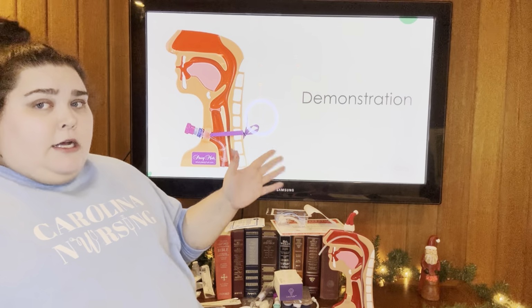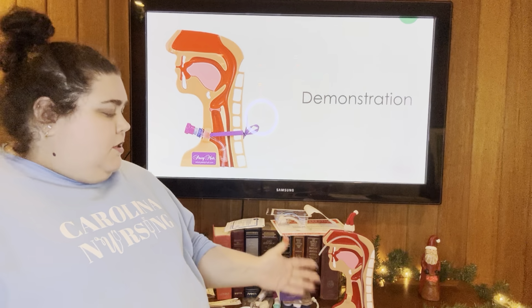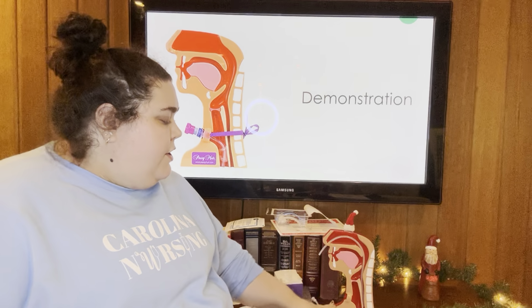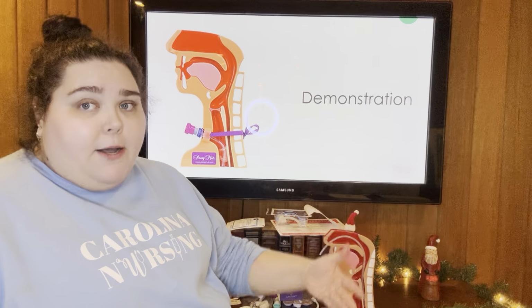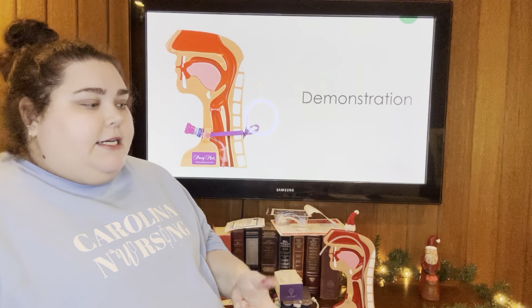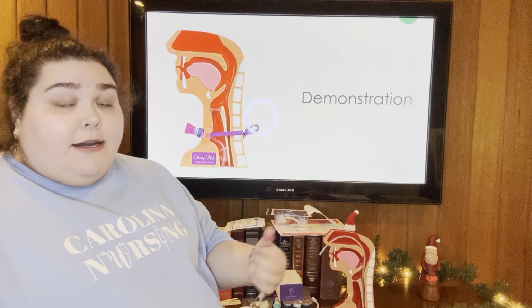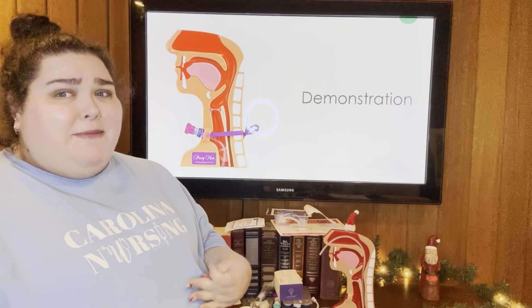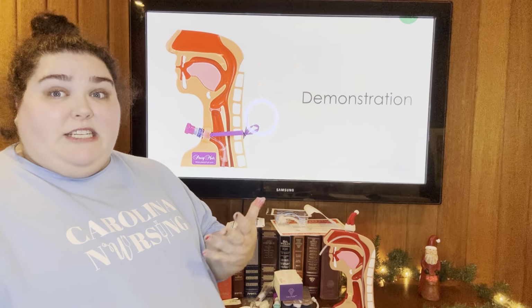So we're going to skip the demonstration. I do not have a trach care kit with me today, but know that you're going around that stoma, around what's exposed of the outer cannula, changing the inner cannula, and getting some fresh ties on. That's a big thing in our hospitalized patients, is we don't change our ties very often, and that is one thing that we need to really be doing.